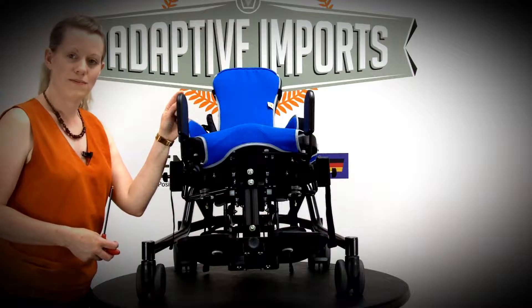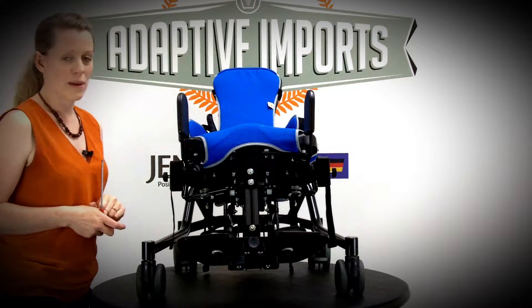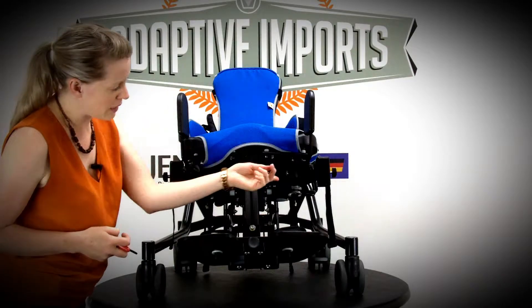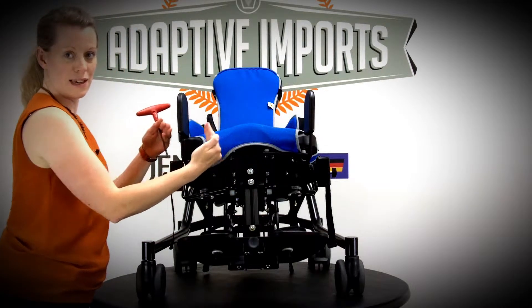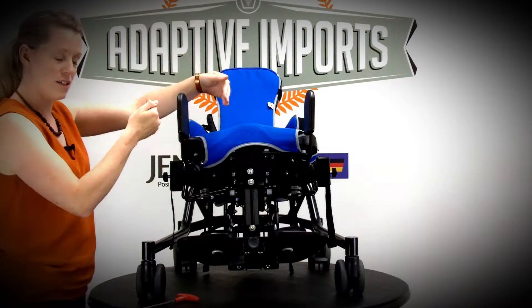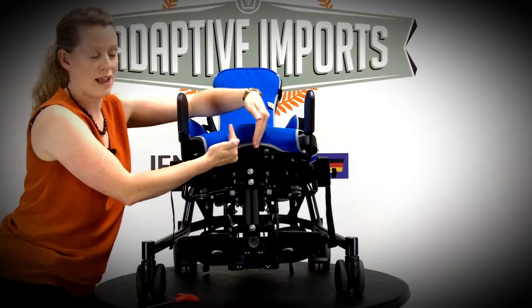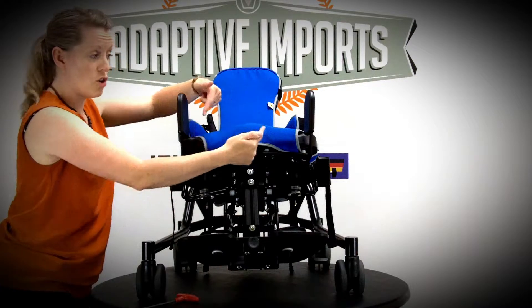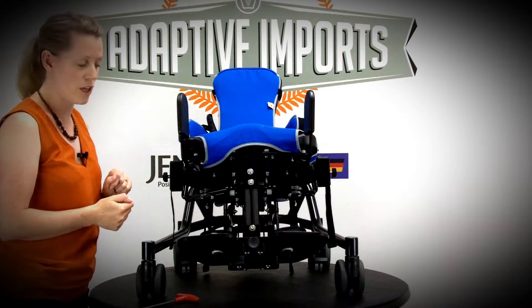The leg control system at the moment is set up to control adduction. You can control the amount of adduction by loosening these screws underneath here and sliding the pads in or out. You can also remove these pads and switch them round, placing them in the middle so that you can control adduction there. Or you can put two sets on either side and really channel the child's legs where you want them to go.